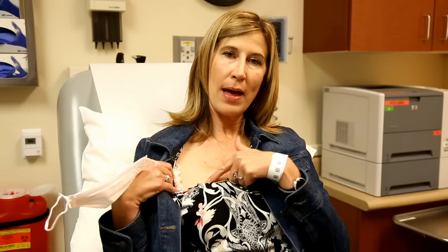It's right here in the chest — you can't really see it that much — and it causes no pain or discomfort. There's nothing that you can't do with it, and it's really easy. So we're going to see how I get accessed. You'll see I will not be screaming in pain; it's actually rather painless — pun intended.